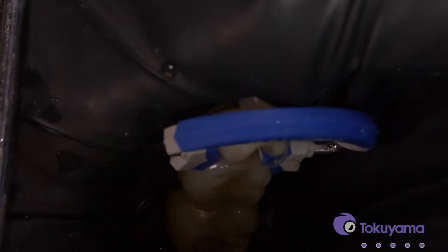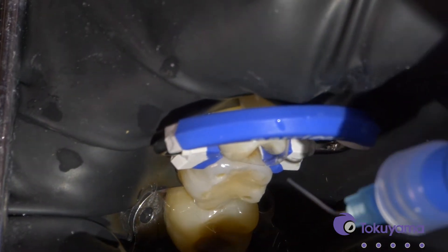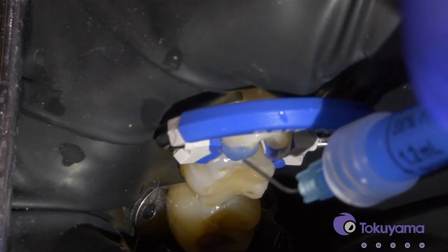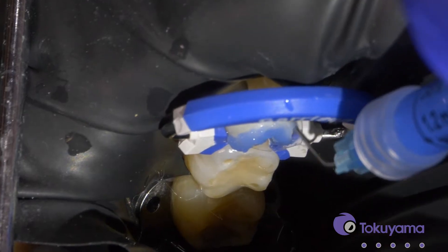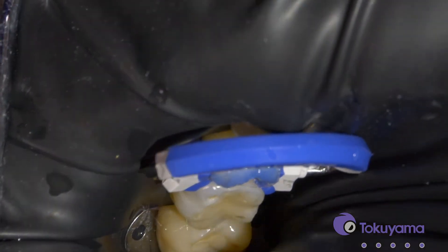Now we'll apply the etch. You can do some air abrasion as well before that, but we'll just apply the etch to the enamel margin. I like to use a selective etch technique, and then we'll let that sit for 30 seconds.